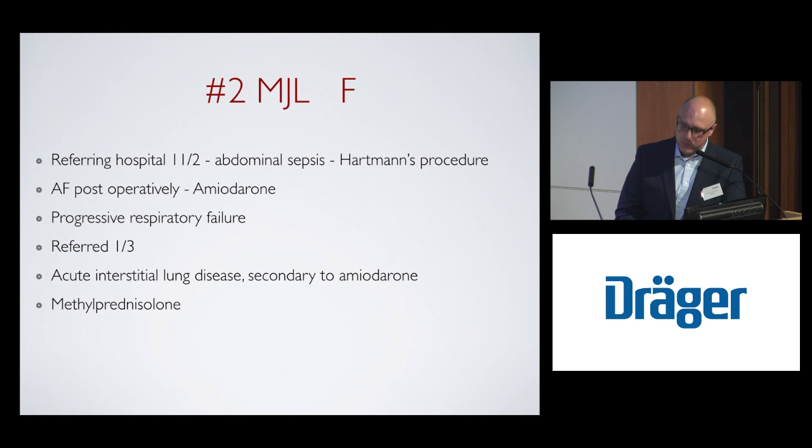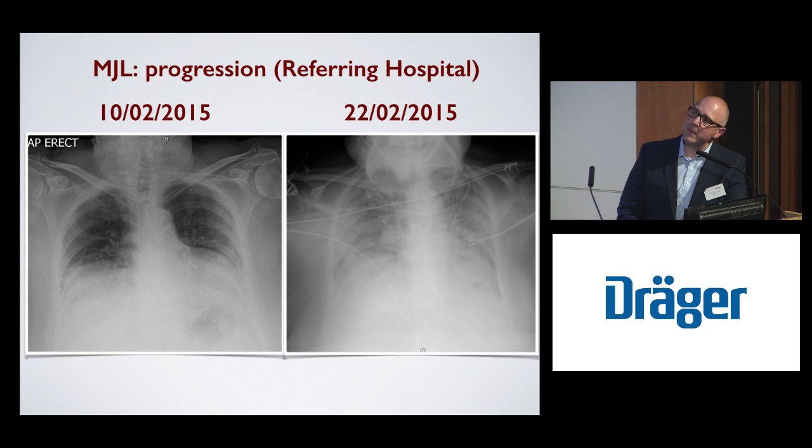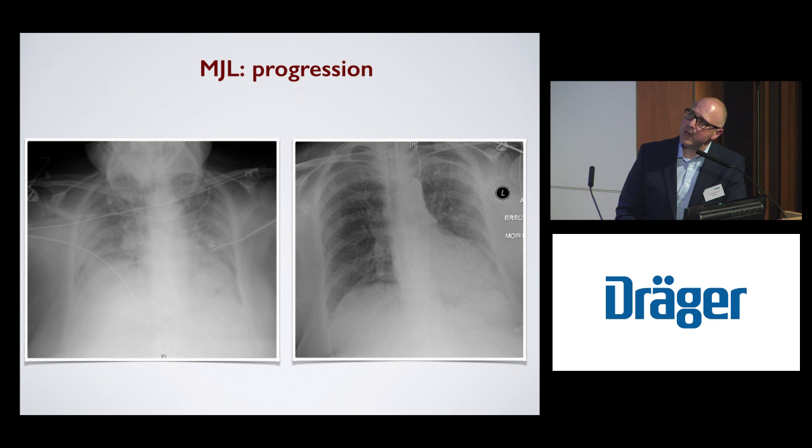She was treated with methylprednisolone. So this is what the chest X-ray looked like from the 10th when she had post-op, and then the 22nd when she was referred. So you can see progressive deterioration. And then she was on APRV. This is what was with us. And you can see that whatever pulmonary edema there was, that cleared. But the chest X-ray is not normal.